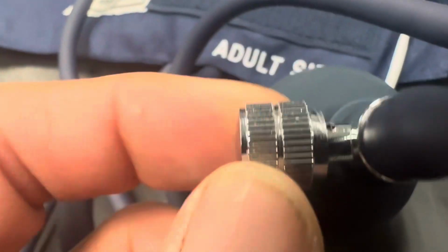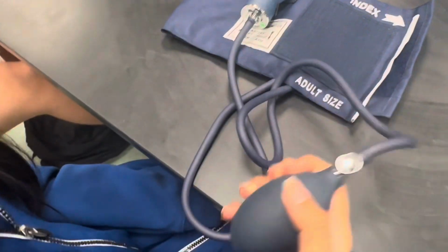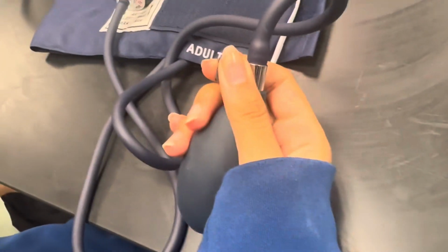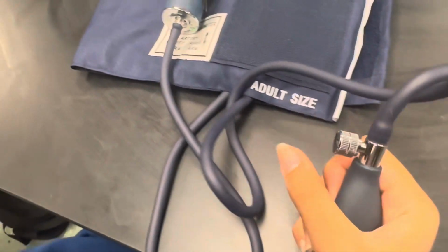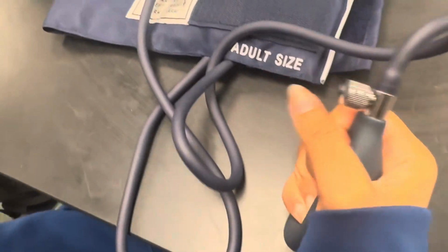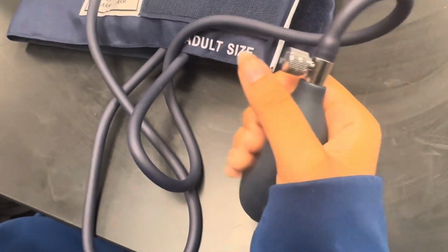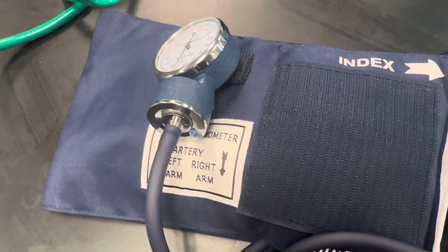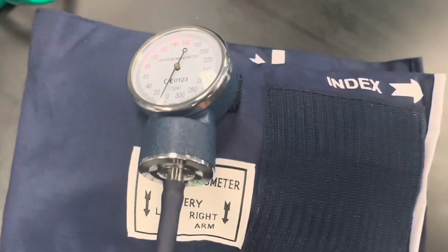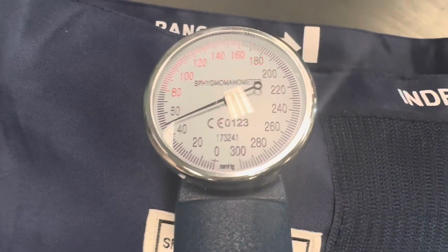So we're going to close the knob, and this is us practicing how to inflate a blood pressure cuff. Okay, you're going to close the knob. So she's closed it. You're going to pump it up. And you have to pump just like at that pace, which is good. And you'll see how the blood pressure cuff inflates. And as it starts to inflate, the number will start to increase. So we're going to increase it to 160.